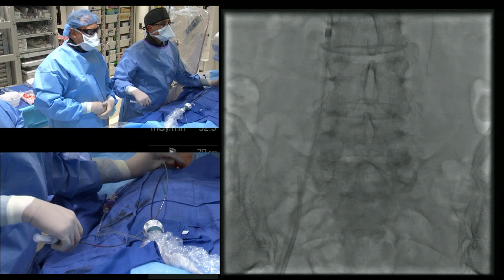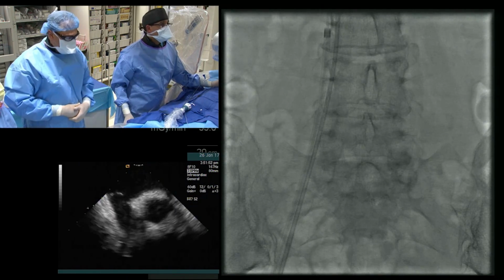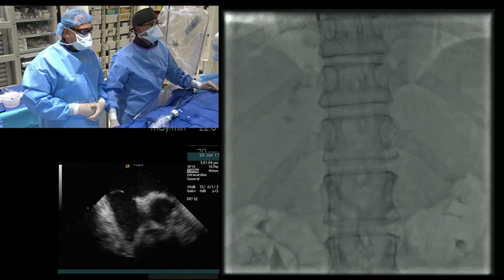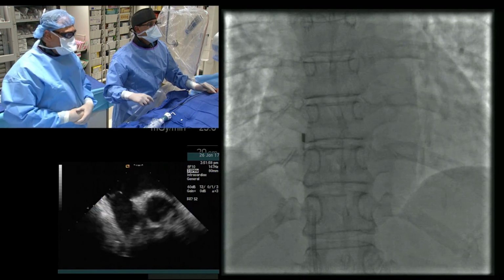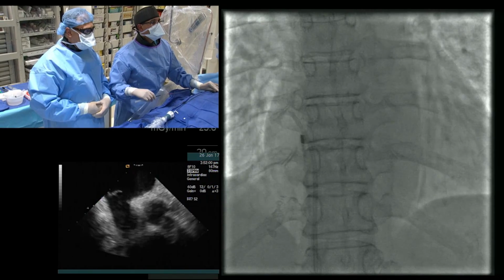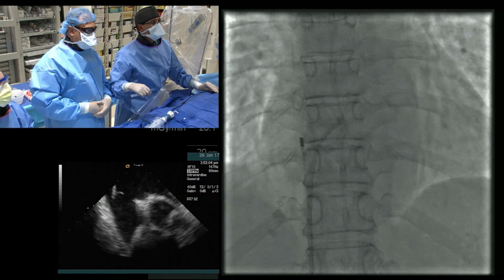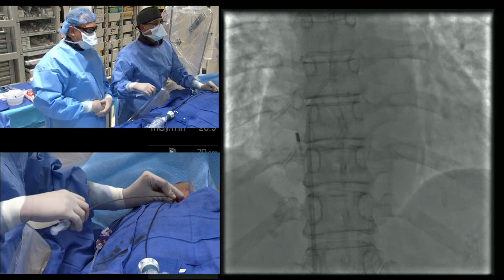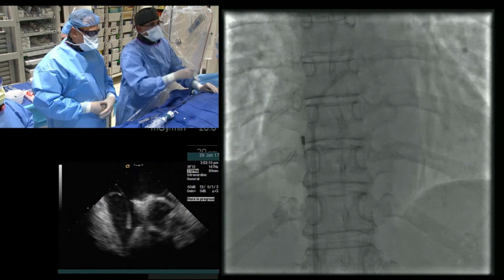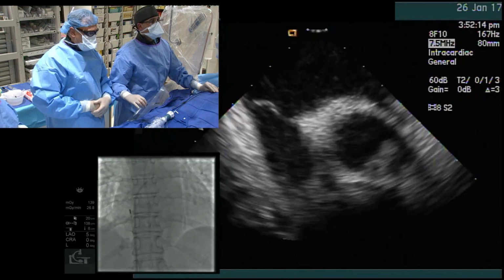So the Goodale Lubin catheter shape is very much like a multi-purpose catheter. And in Europe, a lot of physicians use the multi-purpose catheter to cross the PFO to easily put an Amplatzer wire into the left superior pulmonary vein. So that's also another alternative. But as Andreas mentioned, now you can see the catheter across the ASD in the atria.